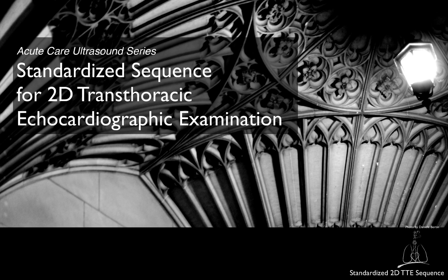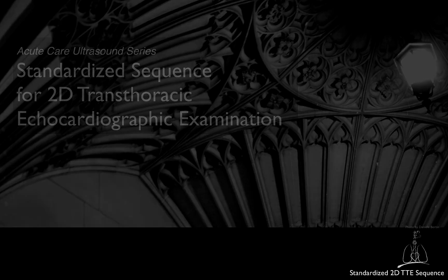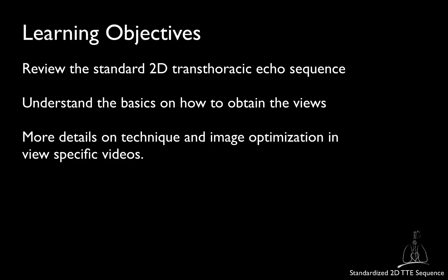The purpose of these videos is to standardize the performance of transthoracic echocardiographic studies and to help the learner optimize and troubleshoot image acquisition. This initial short video will serve as a demonstration of the standardized sequence for a 2D echocardiographic examination. We will not perform any measurements and will only demonstrate how to obtain the views. Please refer to each specific video of this University of Toronto IDCCM critical care echocardiography series for guidance on how to obtain and improve each view.